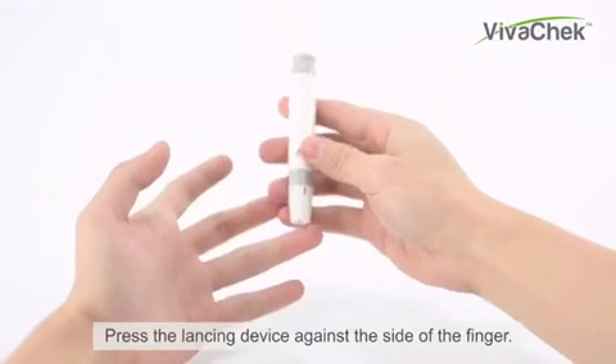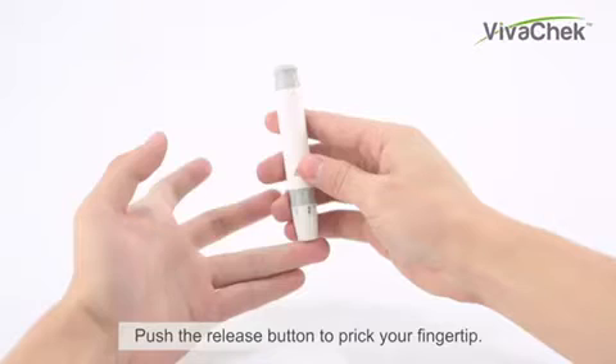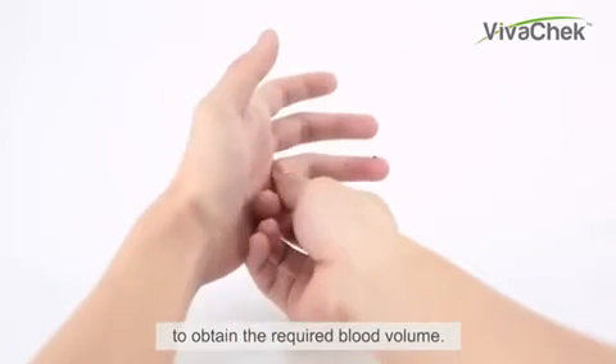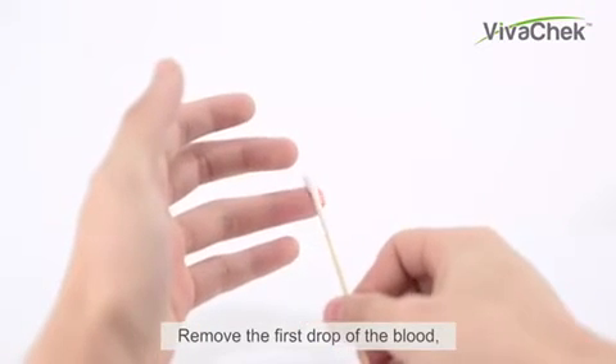Press the lancing device against the side of the finger and push the release button to prick your fingertip. Gently massage from the base to the tip of the finger to obtain the required blood volume. Remove the first drop of blood.